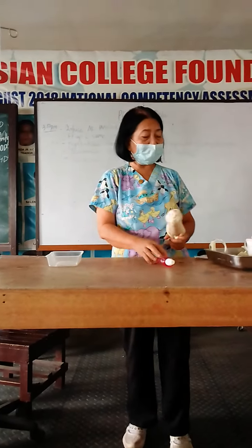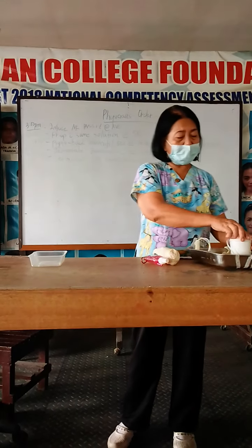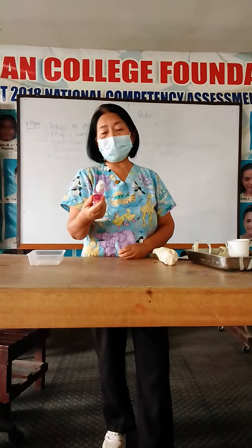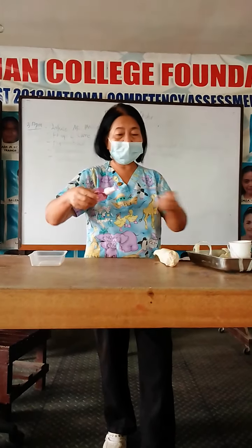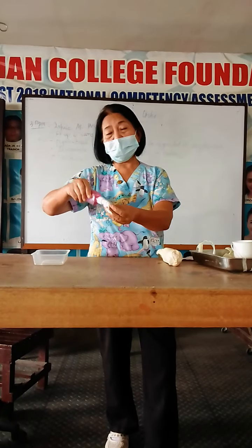Okay, so of course, when you do the insertion, you have to have your cotton balls with alcohol. So, class, I've noticed though, when my students in caregiving or other students of mine are putting alcohol, they do like that. Which is a wrong practice.